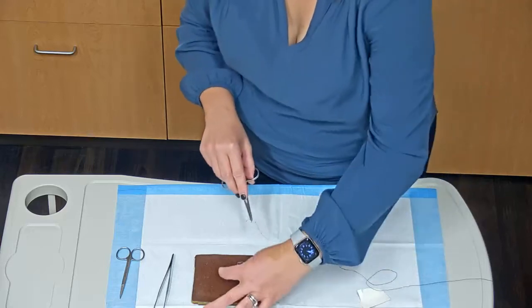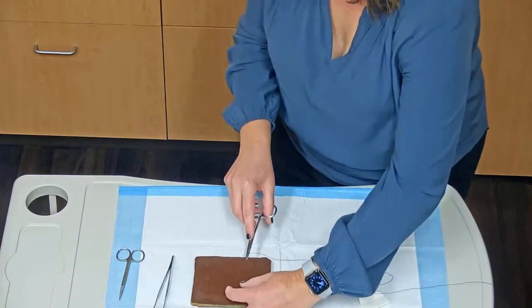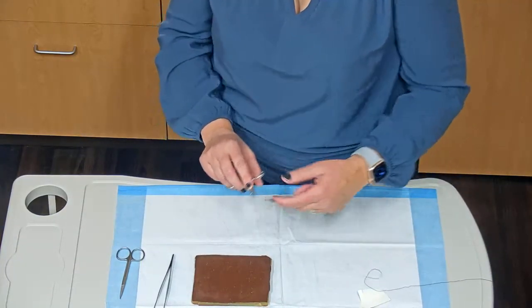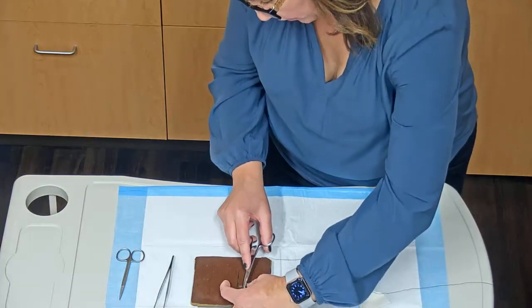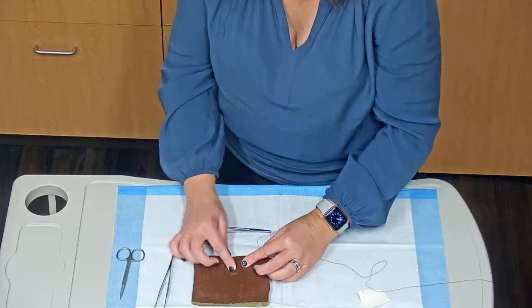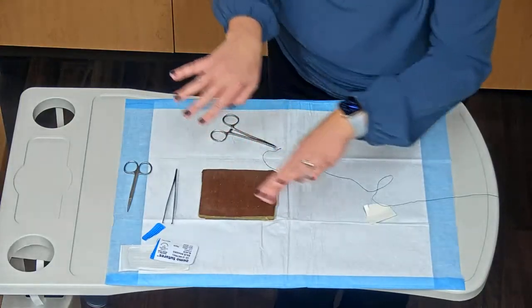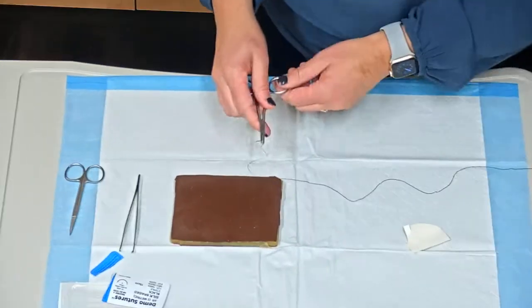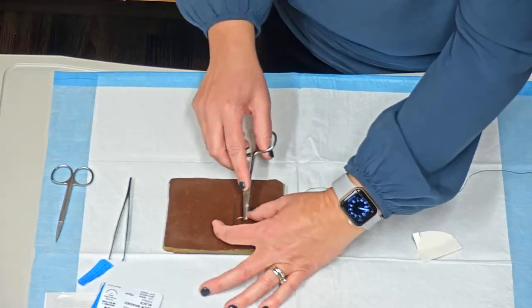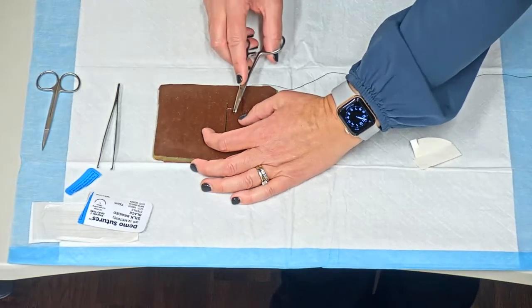As we approach, depending on how long the incision is, we're going to start somewhere in the middle. The first suture type that we're going to go through is the simple interrupted suture. If you start on one end and come down to the other, oftentimes you can have a little discrepancy in the skin or some puckering. So we start in the middle and then work to the edges. This is a great model to work on because it's a nice, well approximated, even without the suture, linear incision.